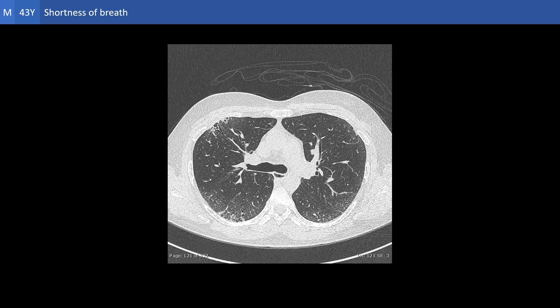Bronchiectasis is the fourth pattern we can identify here. It can be recognized in different forms: either the bronchi or bronchioles have a diameter larger than the corresponding arteries, or their wall is thickened, or they fail to taper, or they can be identified at the lung periphery, where in the normal they should not be identified.